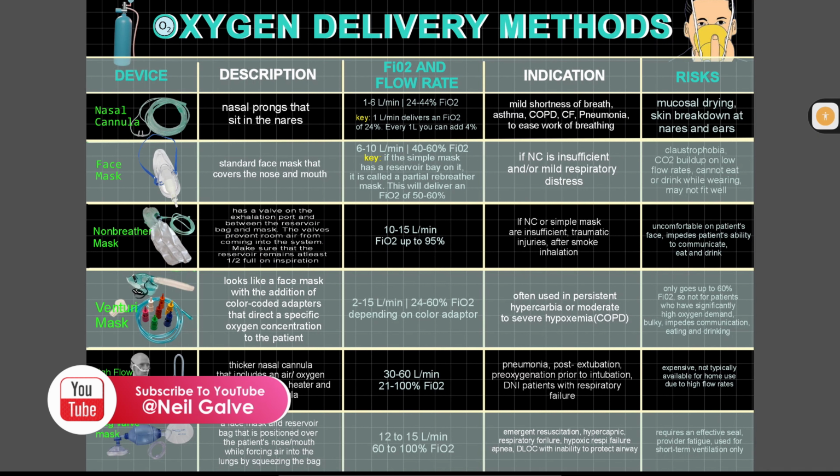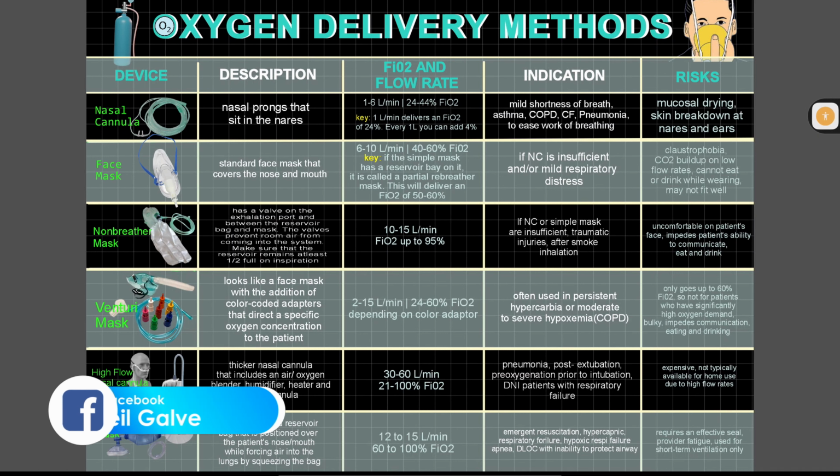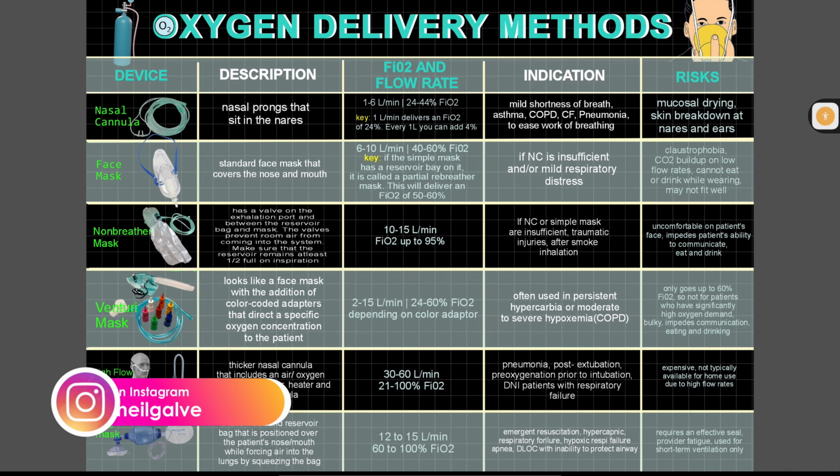Yeah, it's another day for lecture, and like you're seeing on your screens right now, today we're going to be discussing oxygen delivery methods. Now, this is a pretty comprehensive list of the oxygen (O2) delivery devices that we normally have in the unit to deliver oxygen to our patients.